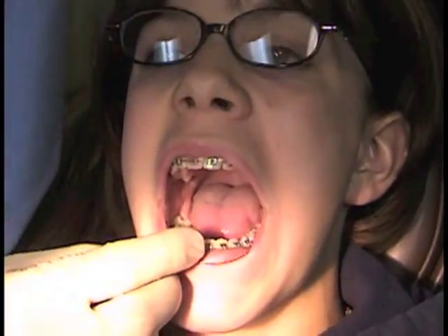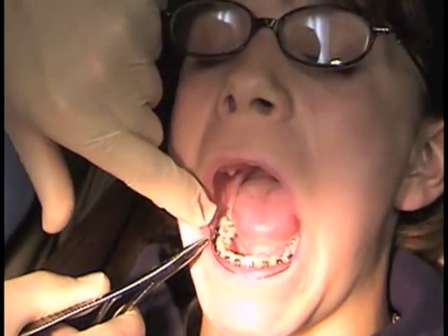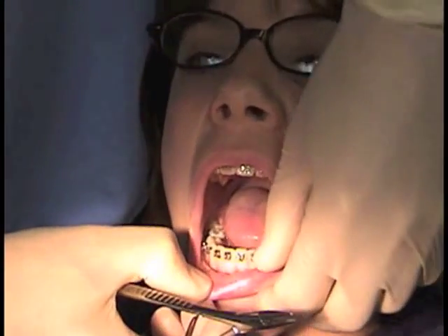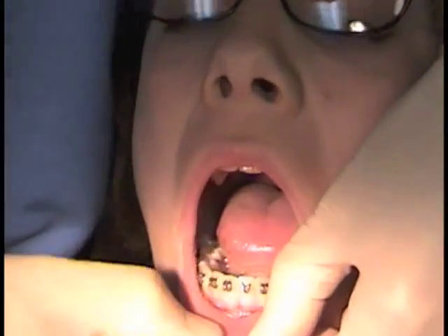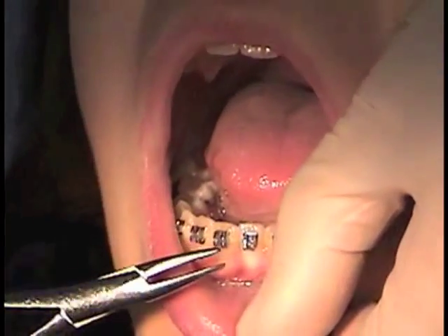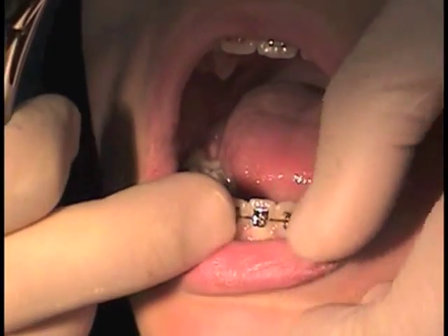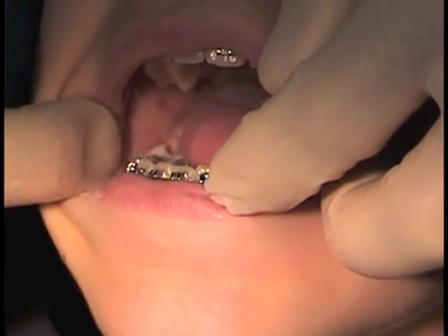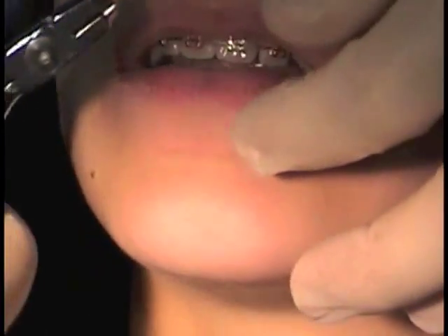I'm going to need a hemostat to help hold this while putting it in. These wires are a little trickier to put in than straight arch wires. Now you can see that when it's sitting passively in the slot, the wire is about 8mm into the vestibule — that's a good amount of curve for an 016 stainless steel arch wire. To insert this we simply push the wire up, put it into the slots, and then clip the ends. Remember there's not much end to clip, so we're not cutting curve out of the wire.